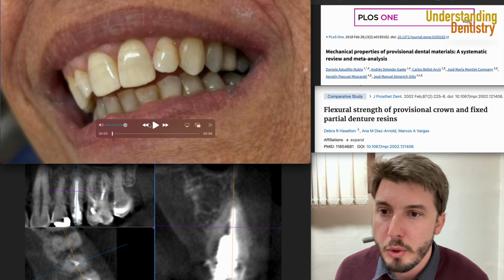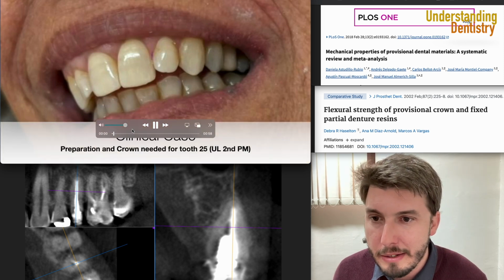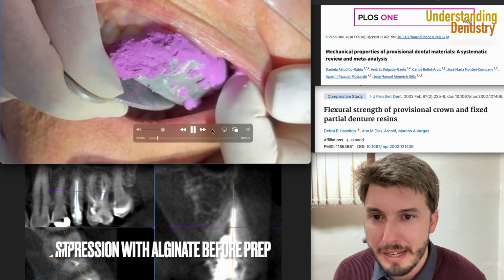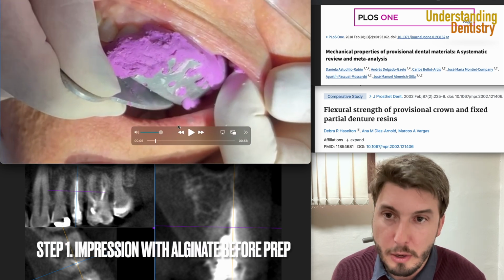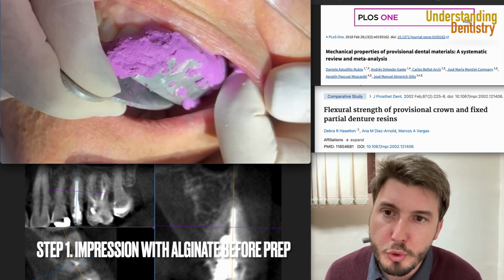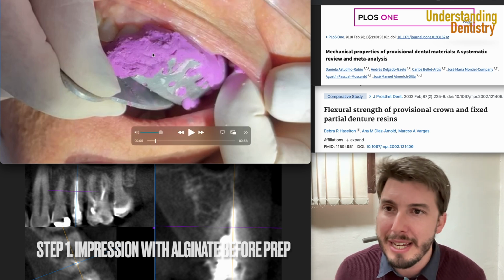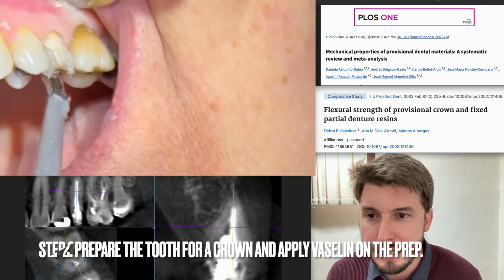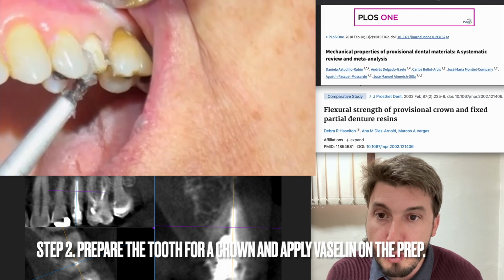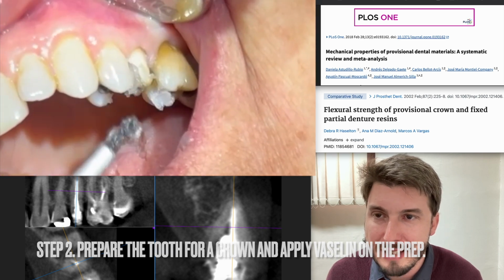Okay, so that's basically the case. All right, so we have here the clinical case, the upper left tooth. We have now the alginate impression, partial tray. You don't actually need a full tray here. You are using a partial tray, and then the alginate. All right, so what we want after this? We want to fill the tooth that you are going to prepare with resin, all right?